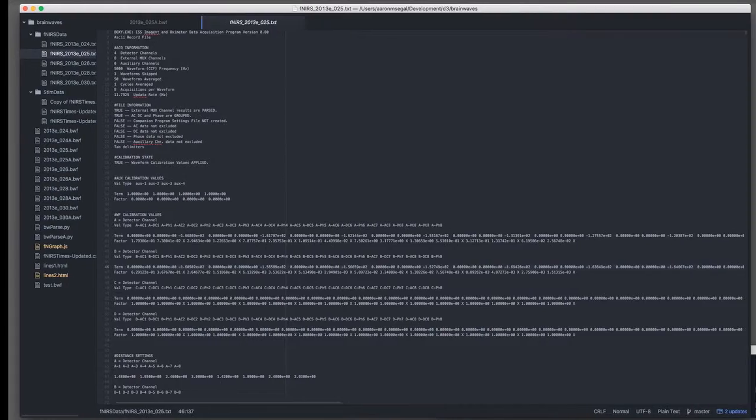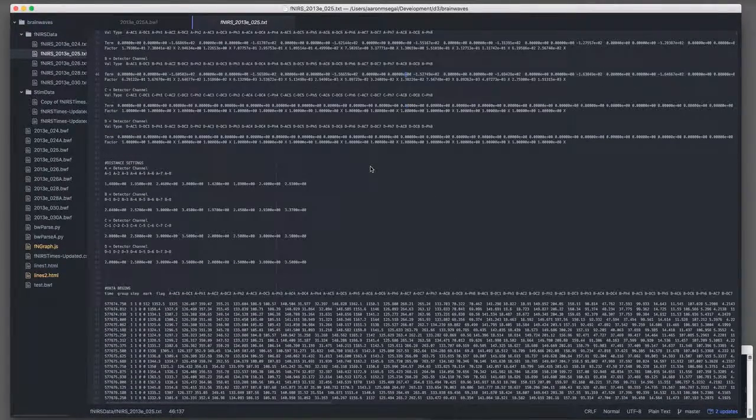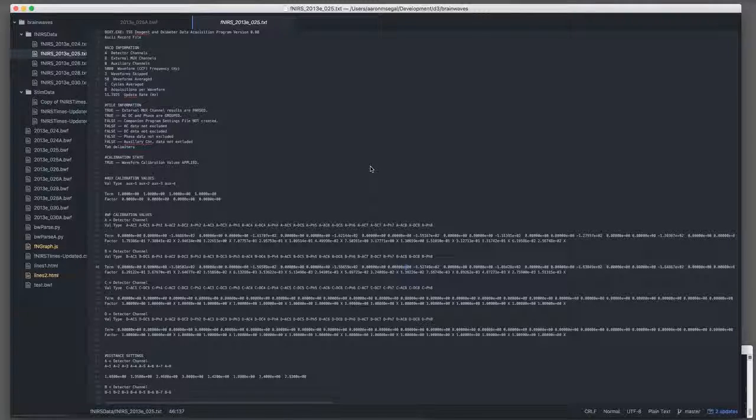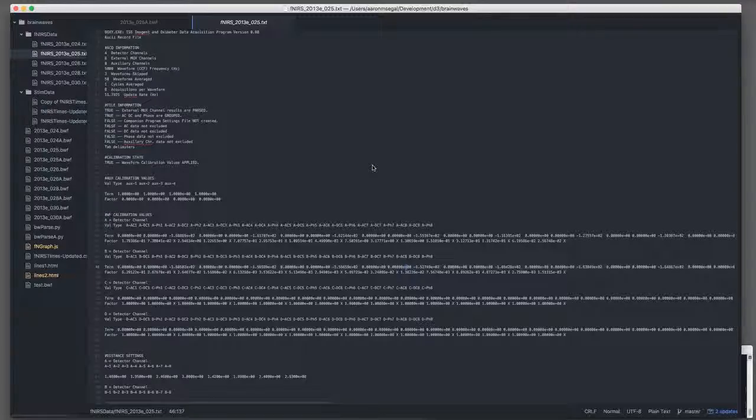So real quick, we're going to take a look at some of the data that comes out of the FNIRS equipment. So here is one of the files from one test subject. I actually had to make sure that I preloaded it before starting this video because it'll take about 45 seconds to load just as a text document because of its size. It has over 30,000 lines.